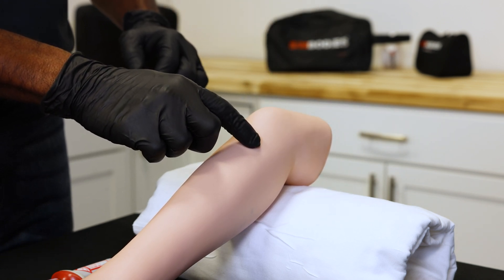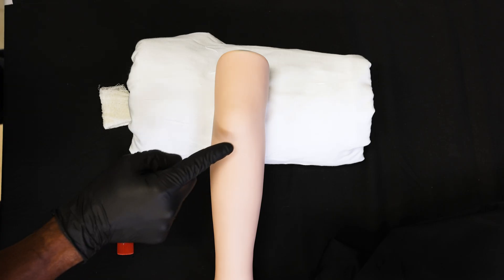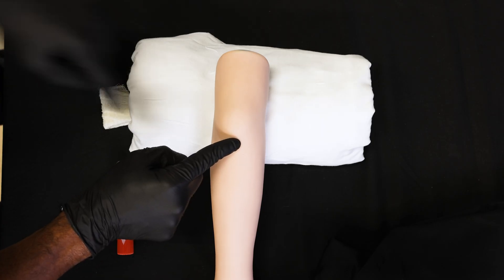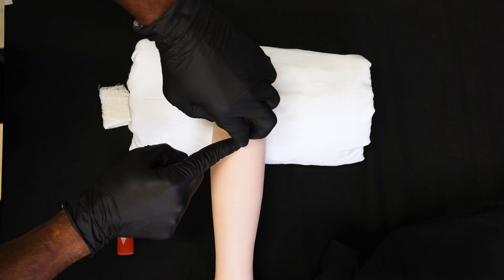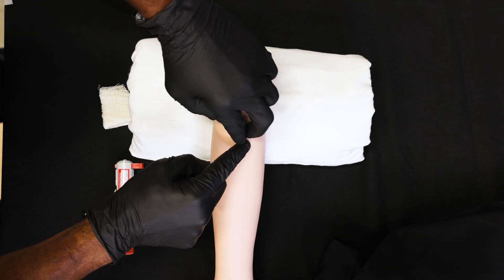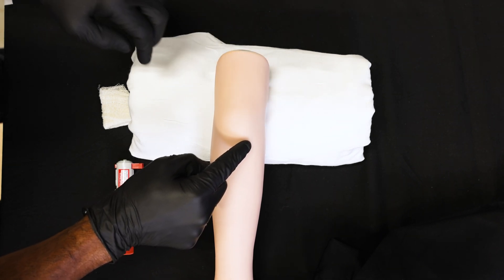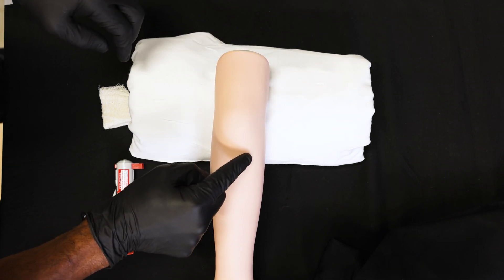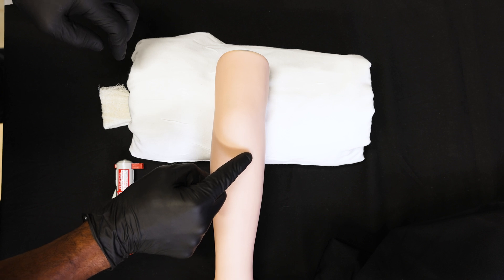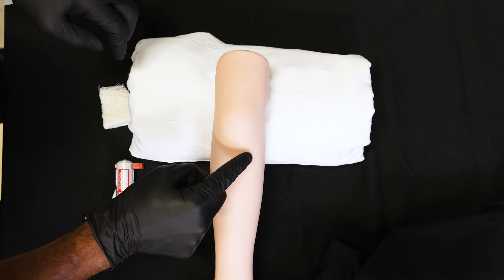For this 9-year-old patient, from the tibial tuberosity we will move 1.5 centimeters medially and then 1.5 centimeters distally. We will use this as our insertion site on the pediatric patient for the Big P.